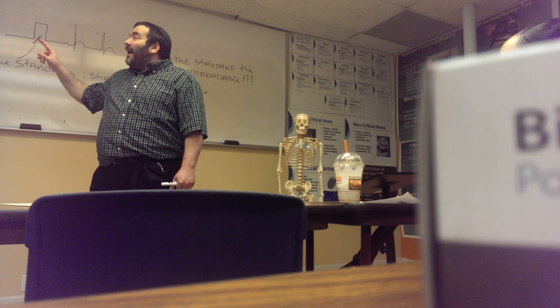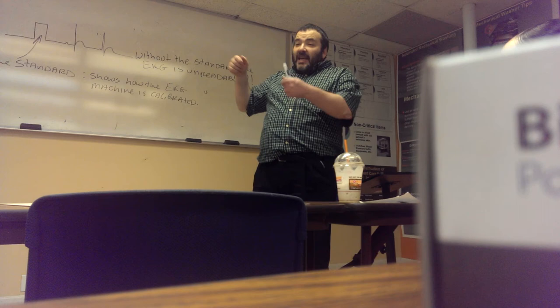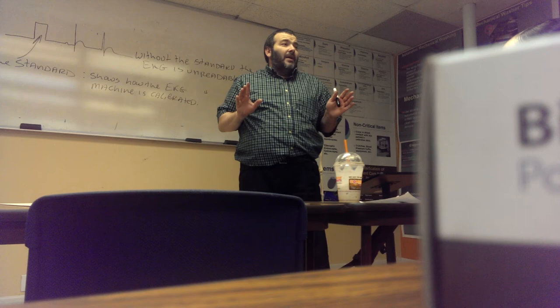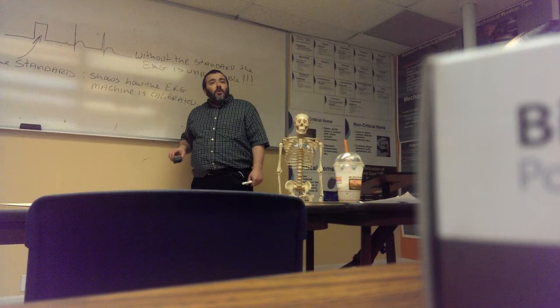It's the box or a set of numbers. They're recorded on a piece of paper. It's either that or that. Okay? Something that shows the calibration of the machine. Otherwise, the doctor will have to take out a little ruler and calibrate it manually like this. If not, the machine tells them. Sometimes it gives both representations. Does this make some sense? Yes. Good. Now I need to tell you a few other things that go wrong with the EKG, and then I put you in Sue's capable hands.